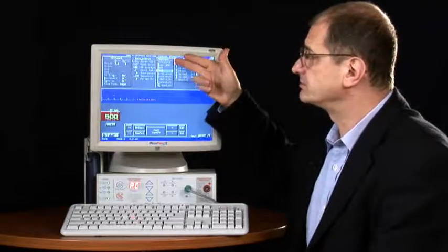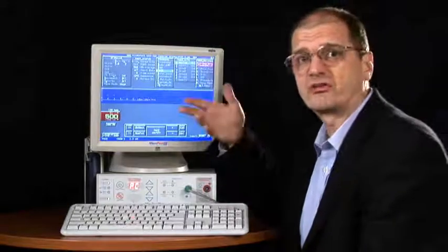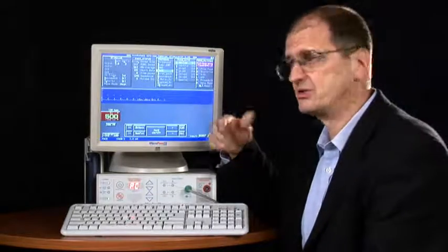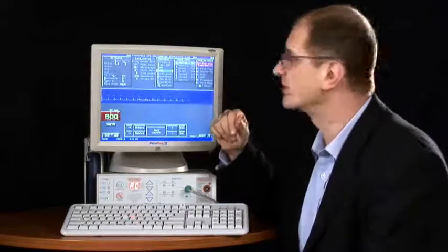Protocol controls what kind of pacing you are going to do, regular or with extra stimuli and so on.